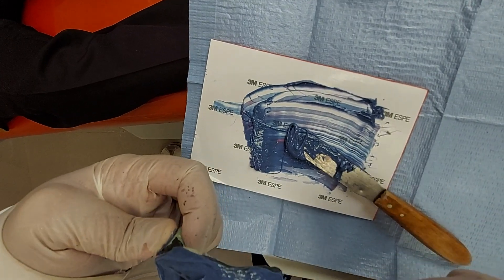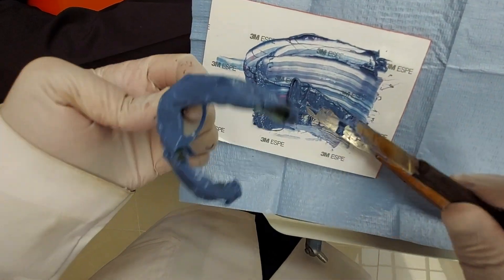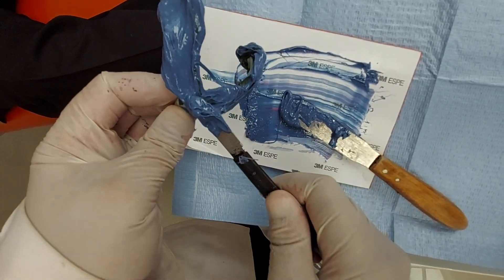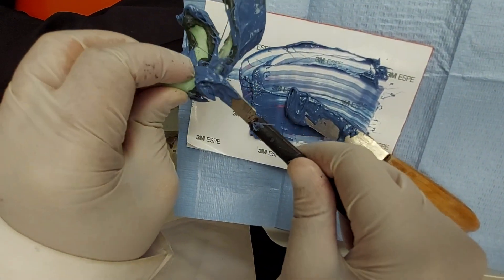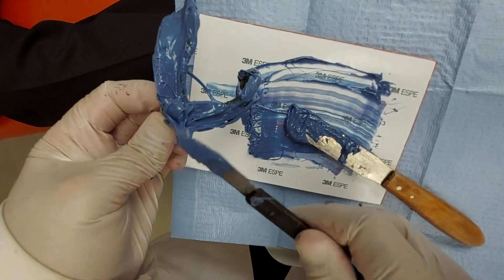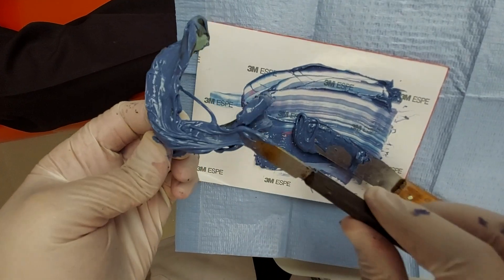I redistribute the material inside the fitting surface and on the borders. Any excess material you can remove — you don't have to apply excess material inside the patient's mouth. As you see, I distribute the material on the tray evenly.